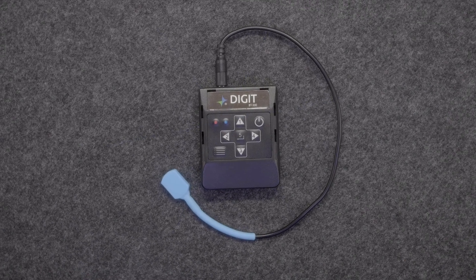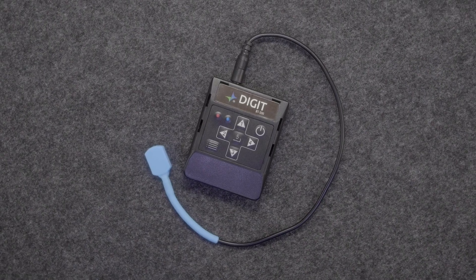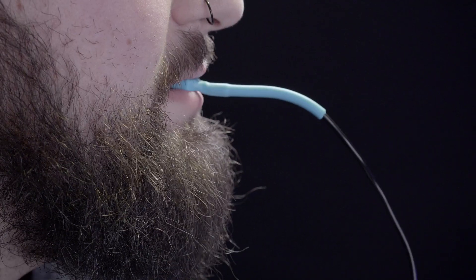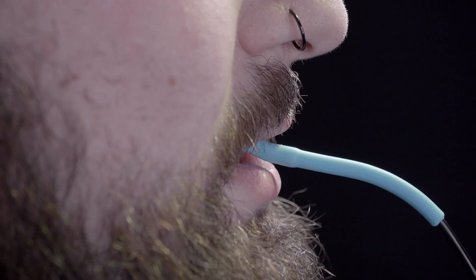The ByteSwitch remote controller bundle comes with an Airturn ByteSwitch and an Airturn Digit 500 Bluetooth controller. The Airturn ByteSwitch is a mouth activated switch that controls games, music, cameras, pages, and more.